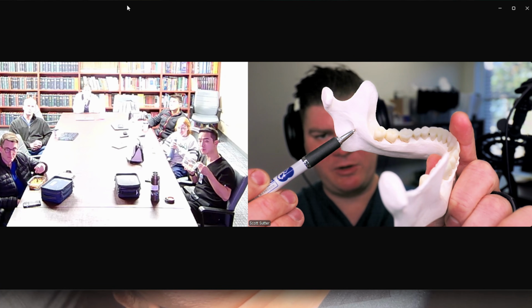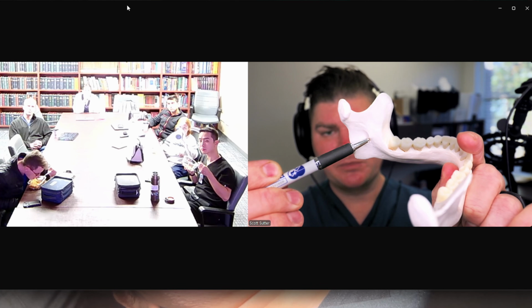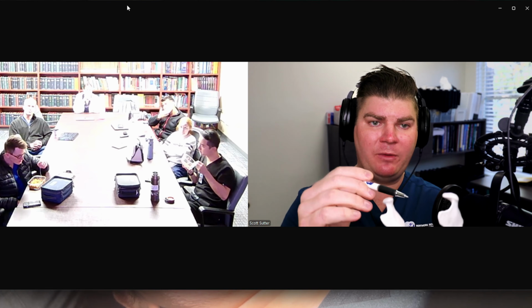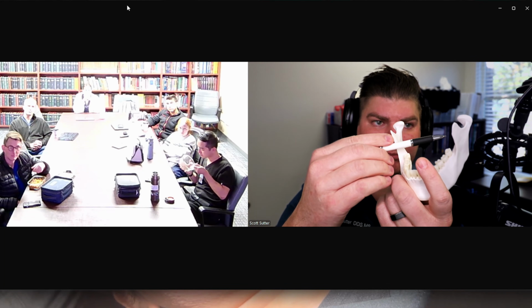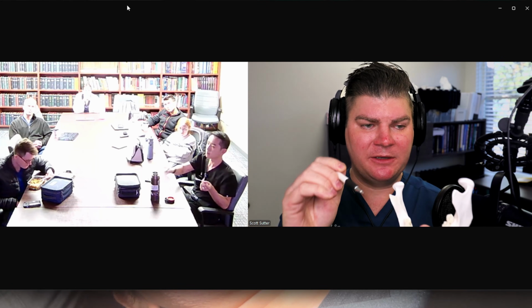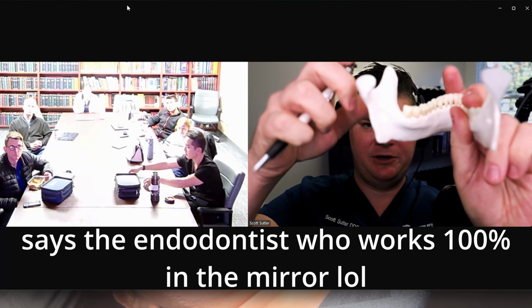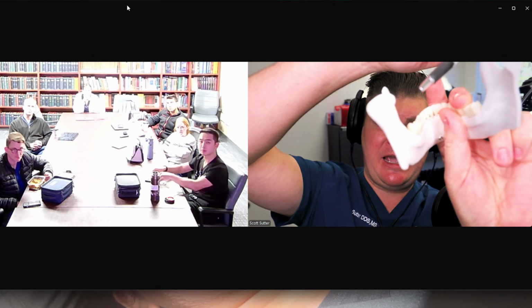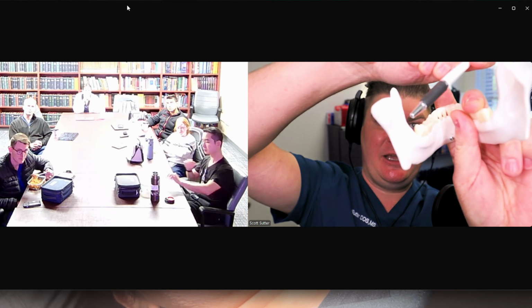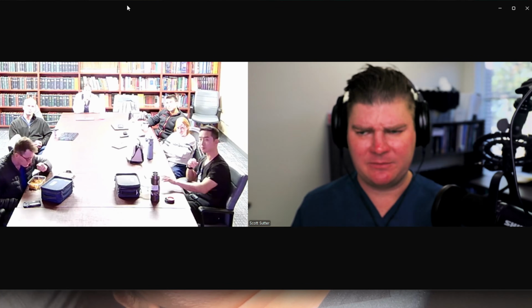Okay, here's where your IA goes in. There is this piece of bone on top of it. You can see me pushing against it. So the way that we were all taught is the direct technique. So you go in and try to just hit it perfectly like this. The much easier way is to deliberately hit the bone. Deliberately hit the bone, walk it back until it drops, and then it goes right on top of where the IA comes in, right where that foramen is. Does that make sense?